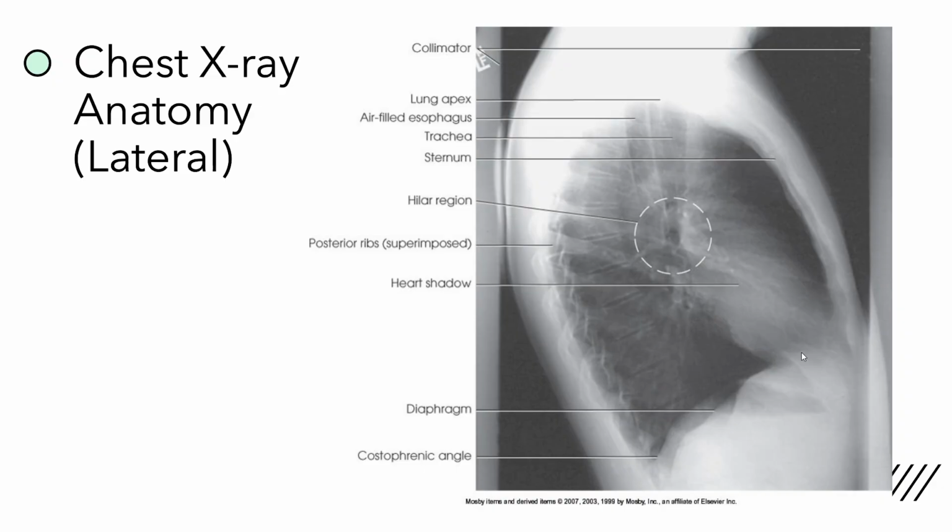Generally, the rule when we take imaging is one view is no view. There are definitely exceptions to that. But in order to see different perspectives of the same condition, generally more than one view is ordered at a time. Sometimes providers will just ask for a P to A chest, but oftentimes you'll see it accompanied with a lateral. You'll see in some courses, or later on in this course also, we'll talk about minimal diagnostic series, where there's a certain amount of different views that we'll look at for a certain body part in order to make it diagnostic quality. Make it so that when you send that to the radiologist, they're able to make an accurate diagnosis based off of those specific positions.